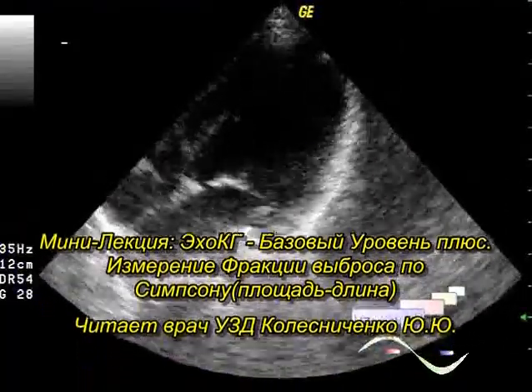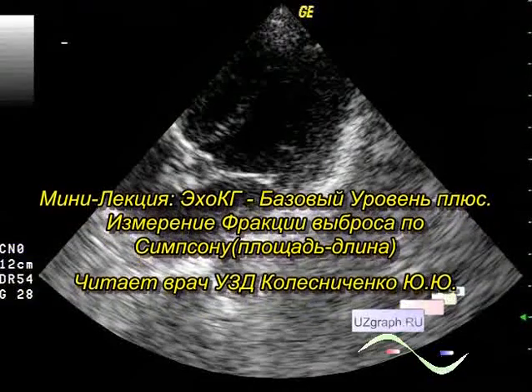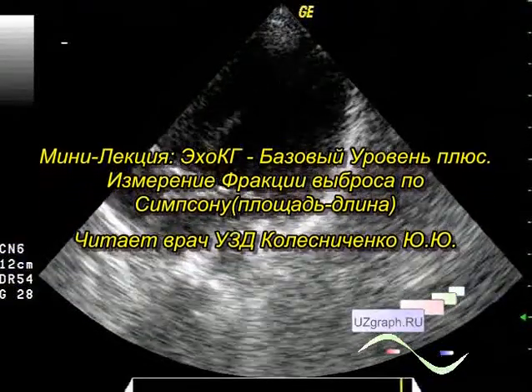Today is a short lecture about ejection fraction by Simpson.